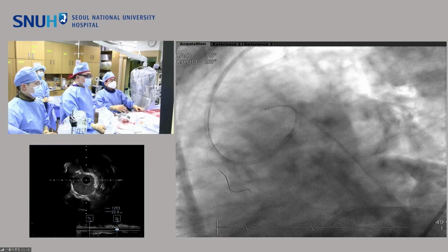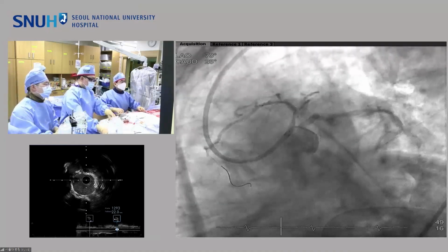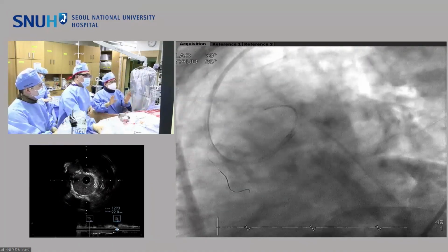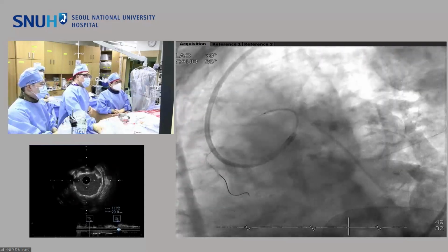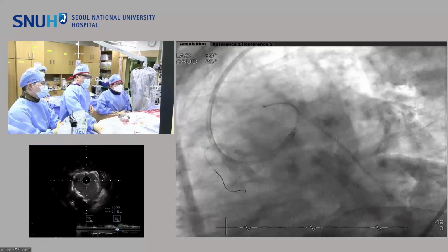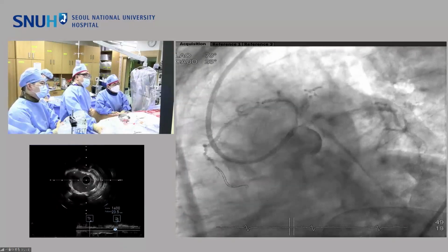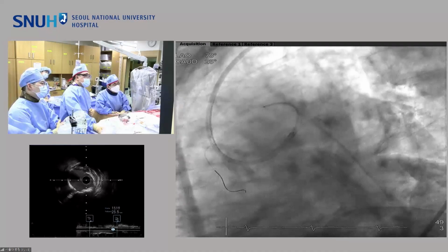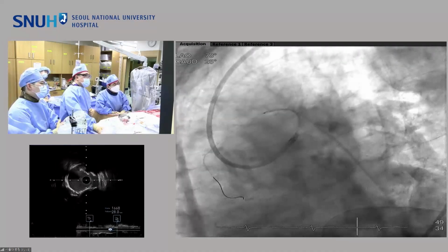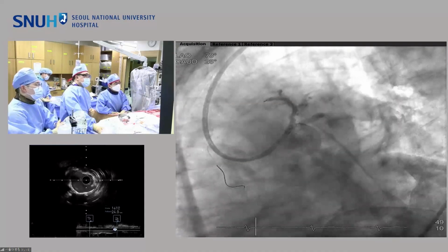Let me show you the fluoroscopic image that we implant. The ostium is a little bit separated. Thus, it is a little bit tricky to localize the proximal stent edge to the exactly ostium of LAD. We found the spider view is the best one. Thus, we tried minus.